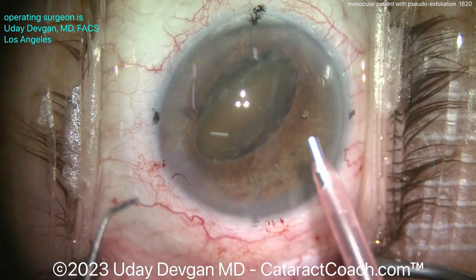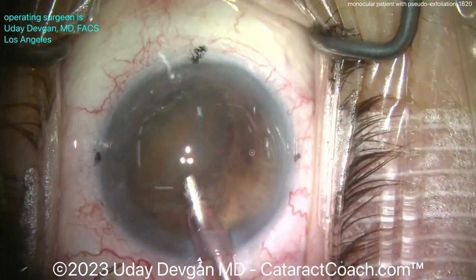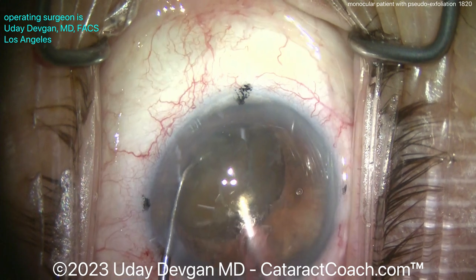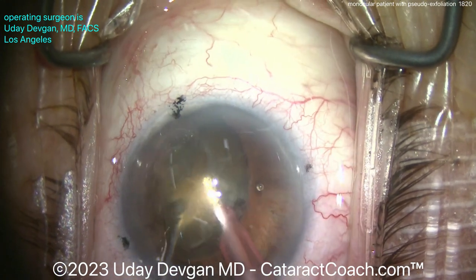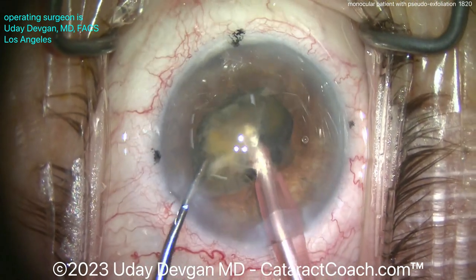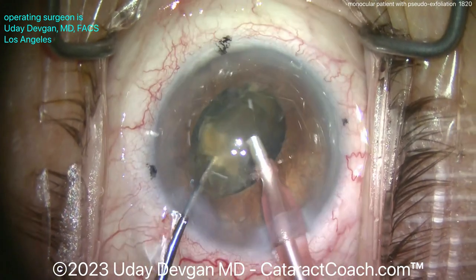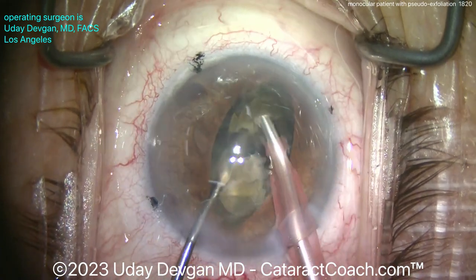We're going in bevel down into the nucleus. The goal is with that chopper to split this nucleus in half right off the bat. Buzzing with the phaco probe, the chopper goes around to the back side of the nucleus — a lot of force required here — and boom, split! We propagate that split all the way through, so now we have two distinct halves. The first half can be emulsified at about the iris plane.